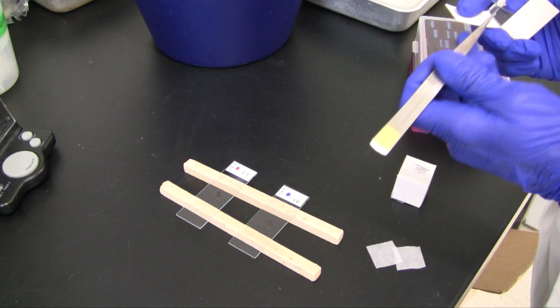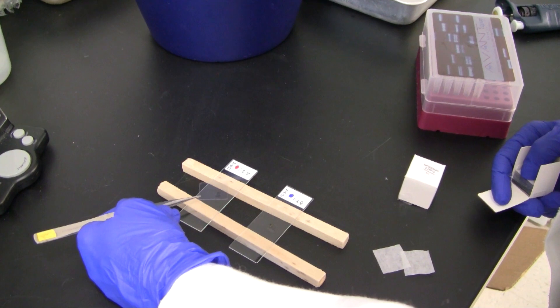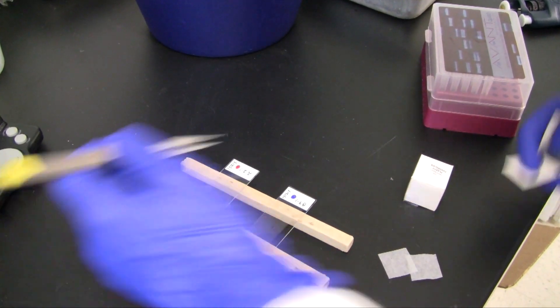Blocking solution is pipetted onto each slide and a plastic cover slip applied so it overhangs the edge of the slide. This will serve as a handle in a later step.